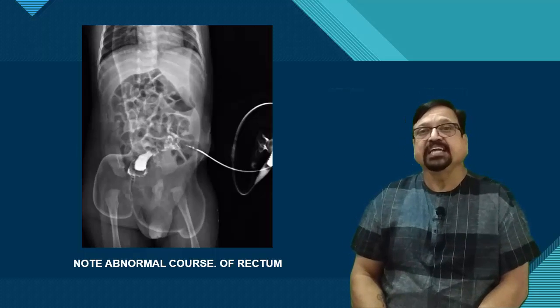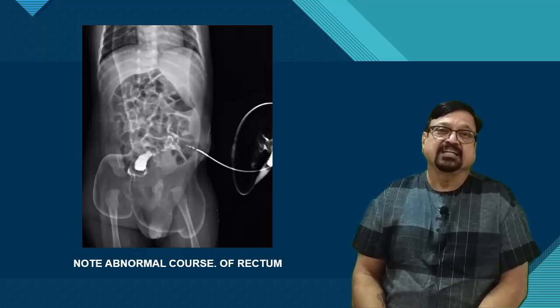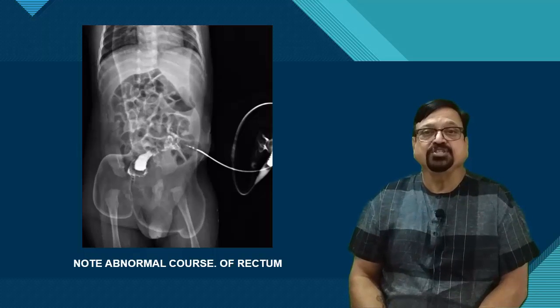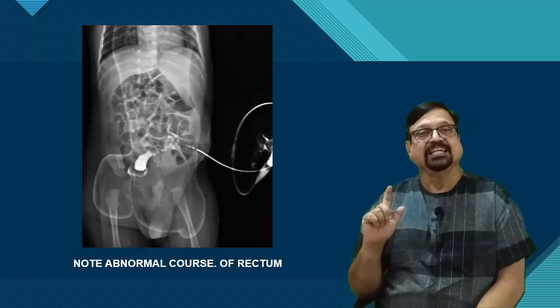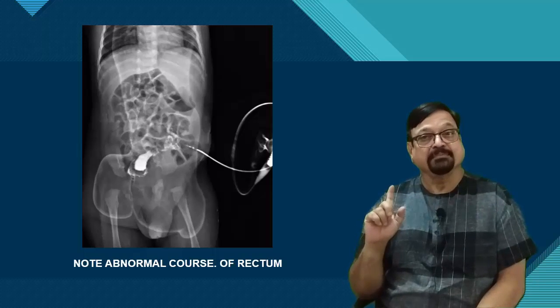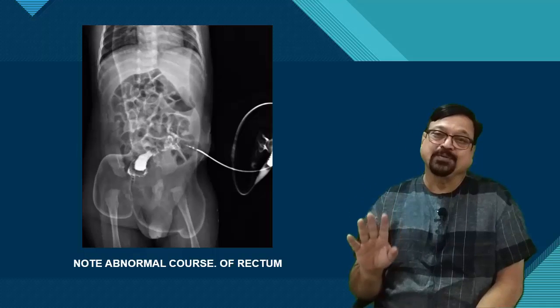But if you see very carefully, the direction is not going to the midline, but towards the right side. Now again, in the upper films, the stomach is not seen, but the liver is seen. The liver is on the left side. Left-sided liver, again you have to make a mention of it, as it is one of the additional abnormalities. So in this patient you may have a rotation of gut in addition to the ANO-RECTAL malformation.